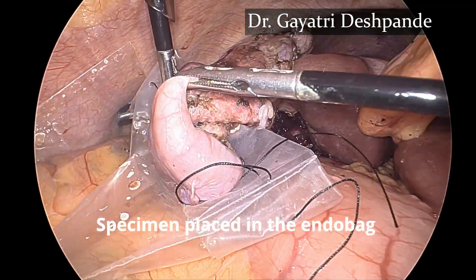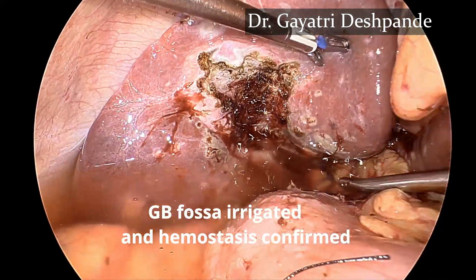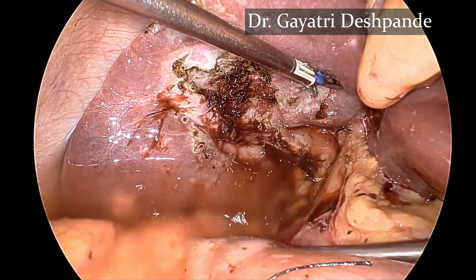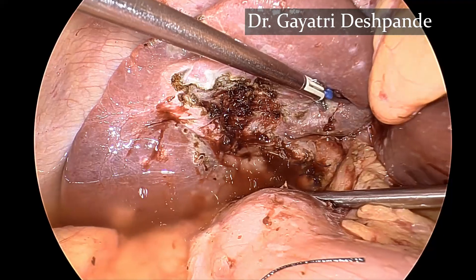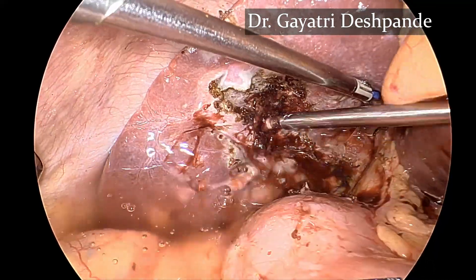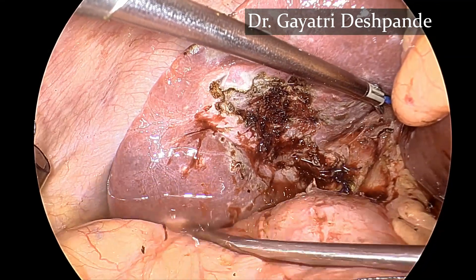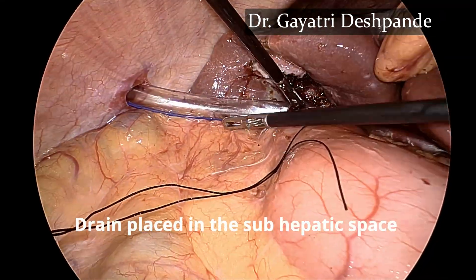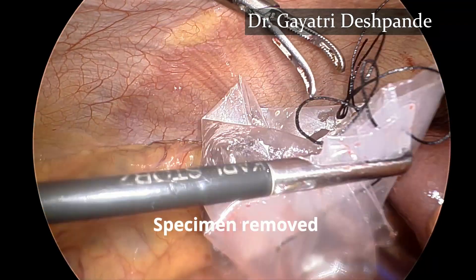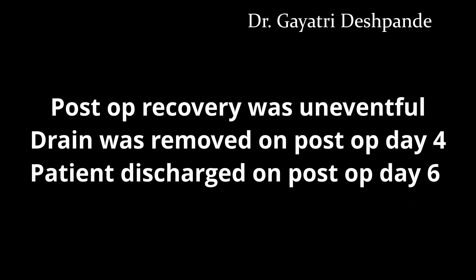The specimen is placed in the endobag and the gallbladder fossa is irrigated thoroughly to clear off the bile and confirm hemostasis. A drain was placed in the subhepatic space and the specimen was removed through the endobag. The post-op recovery of the patient was uneventful.